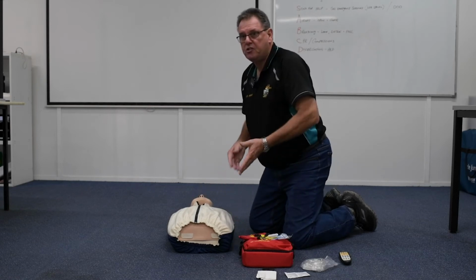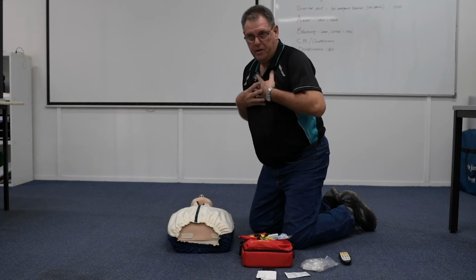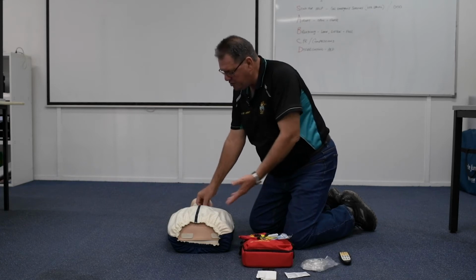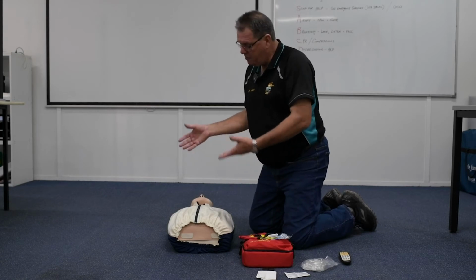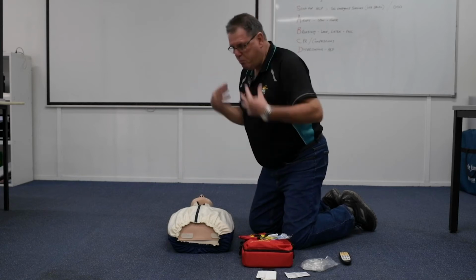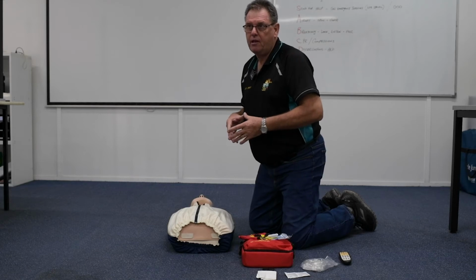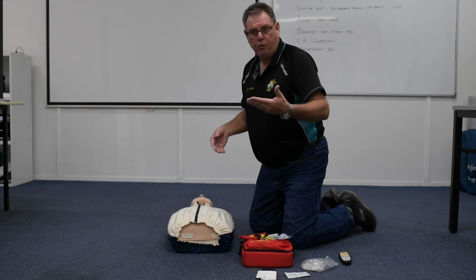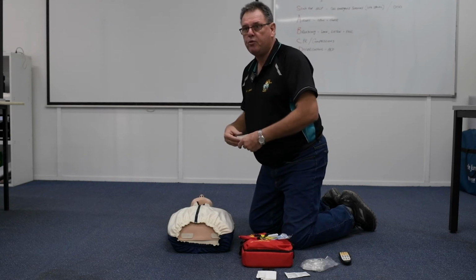As I mentioned previously, if we have a female patient, it's vitally important, well, to me it is, to protect our patient's dignity. So if the patient was wearing some clothing like this, it may not even be required to take the whole shirt off. Or you could take it off, and once we've got our pads on, put the shirt back over the patient to protect the patient's dignity. I always talk about thinking about if this patient was your wife, your partner, your mother, your daughter, how would you like them to be treated? So that's important to me.